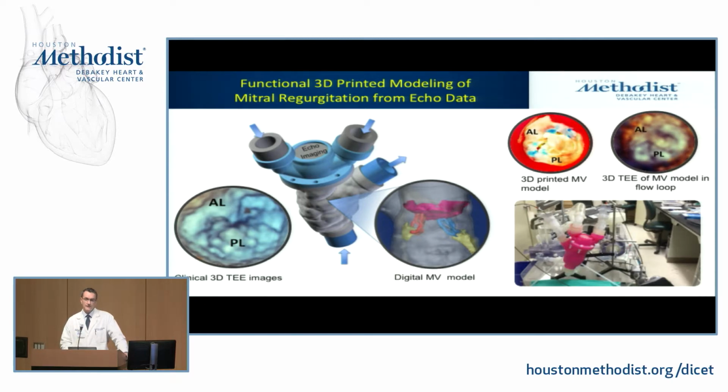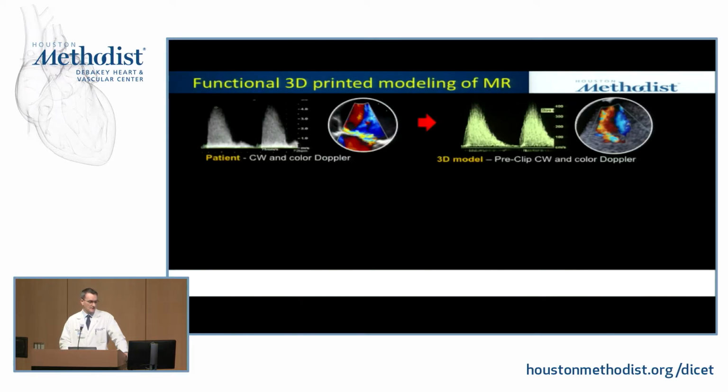Then you have a really nice test platform to practice specific procedures for that specific pathology, to try to predict how many clips, what size clip, is clip even the right device? Maybe we should be using one of the newer devices that's coming along. So now we have the ability, or are getting closer to the ability, to test these things without being inside of a patient.